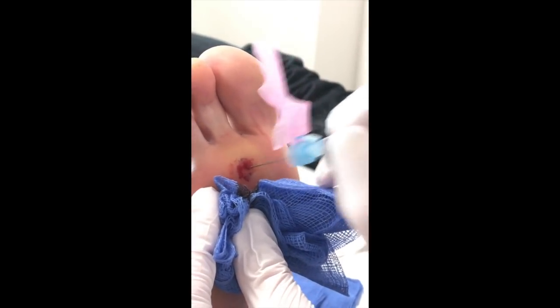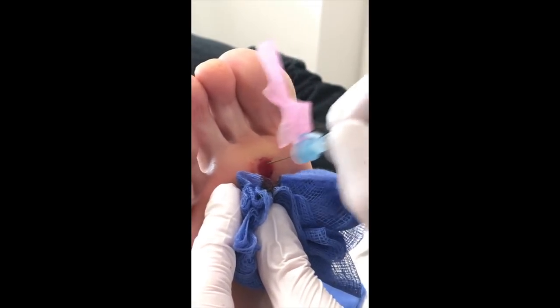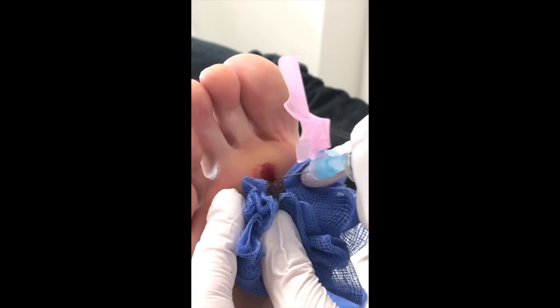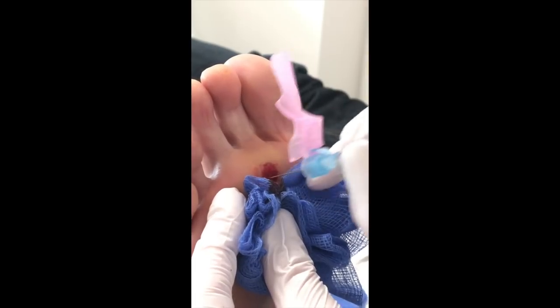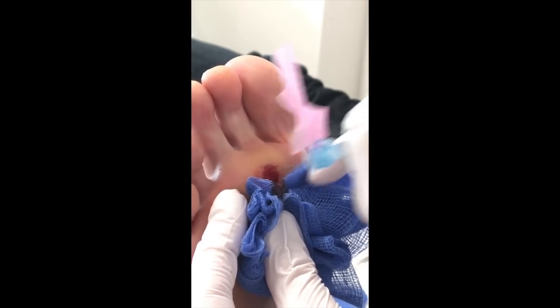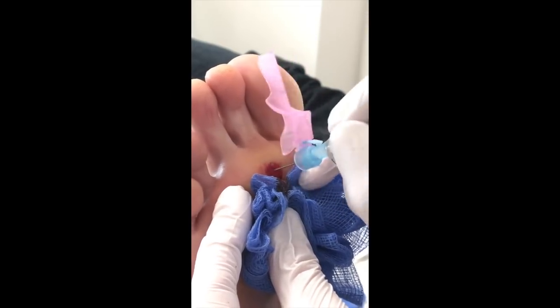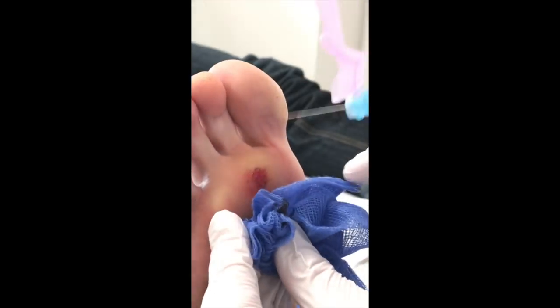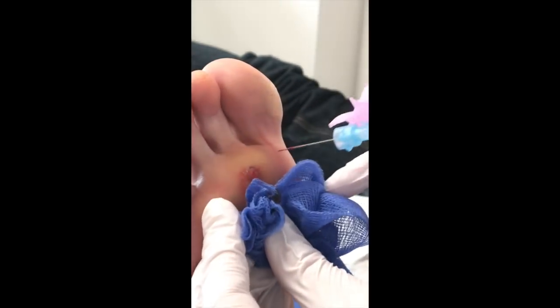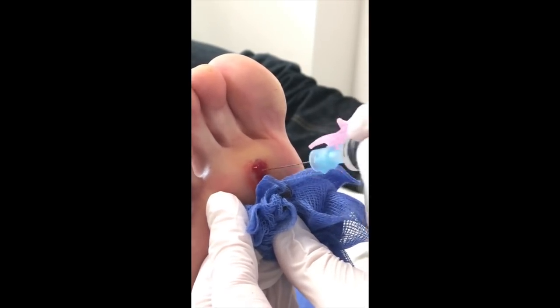How's that going on the video? That's a nice job, Mrs Nick — not her real name either. You can really feel when it's here — it's all nice and soft. So you want to stop when you don't feel any more resistance, and you do this really a few hundred times. I've been kind of skimming the surface of it when it's painful — that helps, because the thickness of the callus is what makes it sore.